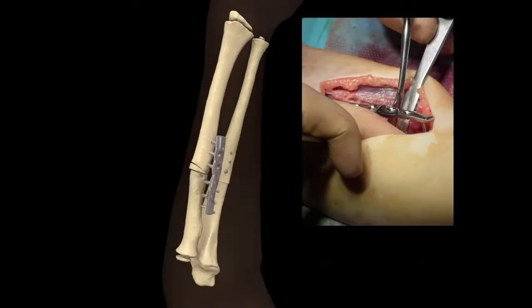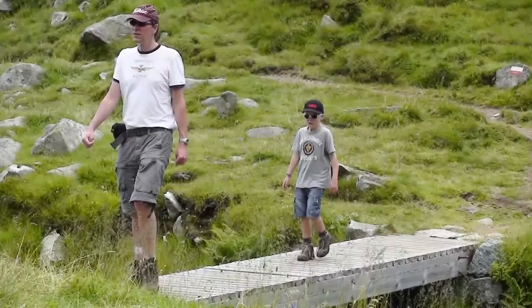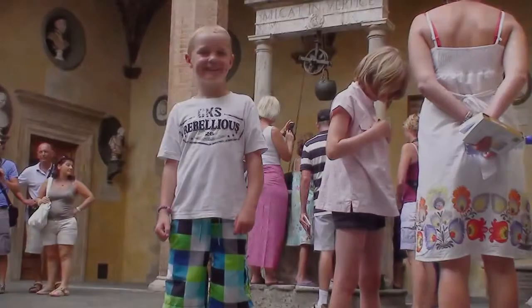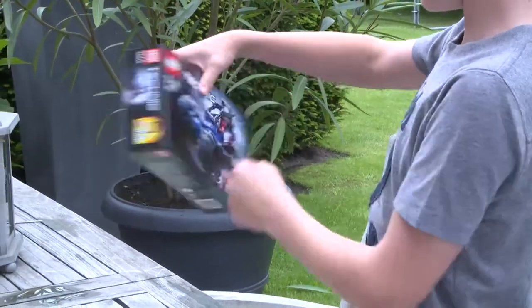Kathleen was thrilled that even just a few days after the surgery, Joos regained the feeling in his fingers — a sensation he had not felt for six months. Without surgery, Joos would probably never have been able to play volleyball or do typical everyday things. Unfortunately, in Joos' case, health insurance did not cover the expenses for this procedure. His parents are convinced that this surgery was the only possible solution to help their son, and that without this treatment, their boy would have had to live his whole life with a handicap.